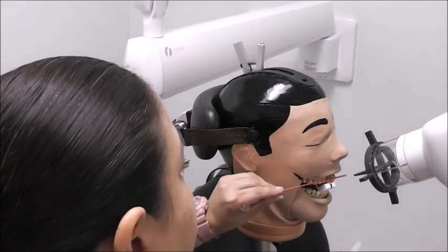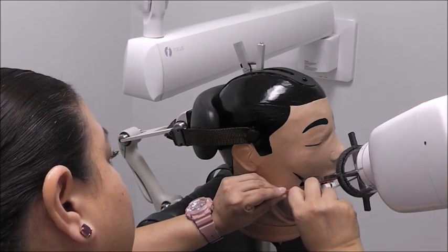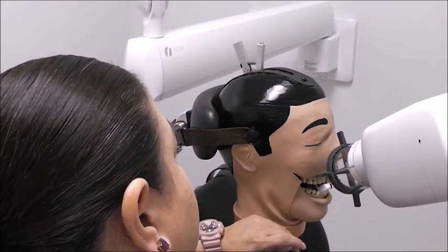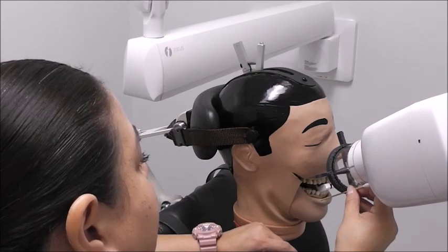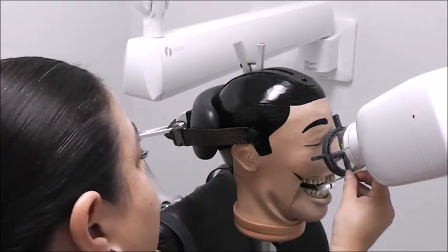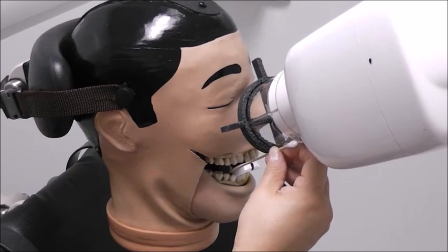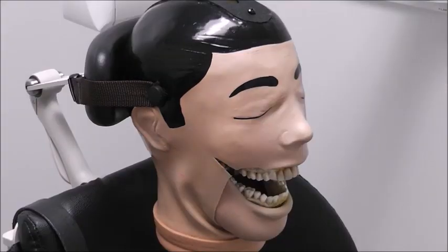This is our vertical angle — make sure those two are parallel. This is our horizontal angle — parallel those two as well. The central ray is going to be in the center of our plate. Make sure the bottom of the collimator covers the bottom of the plate. Now we're ready to expose it.